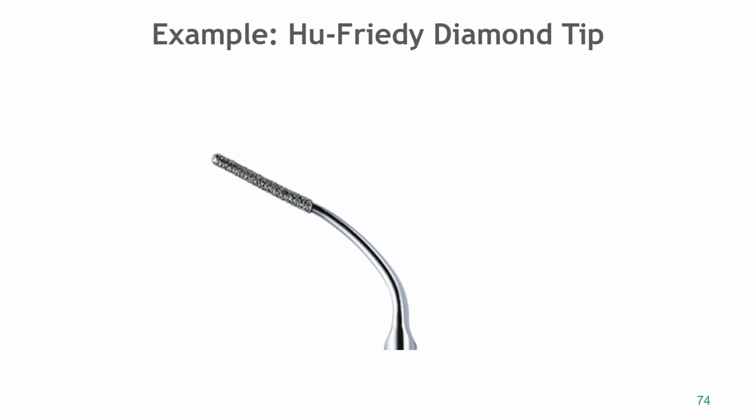So it's important that you only use it on the overhang. I think we do have a couple of these in the clinic. And like I said, we're going to go over how to use all of these things on our ultrasonic clinic day, okay?